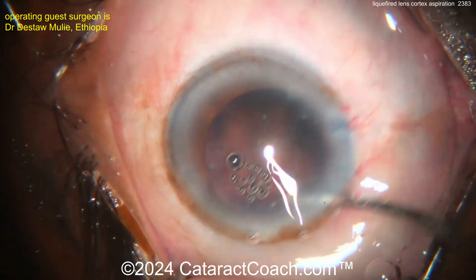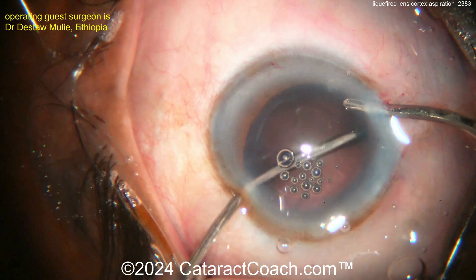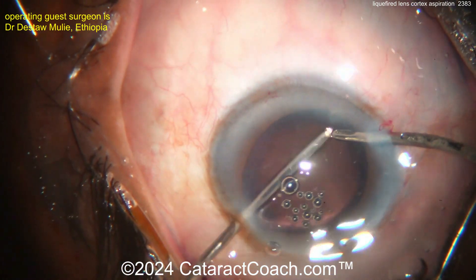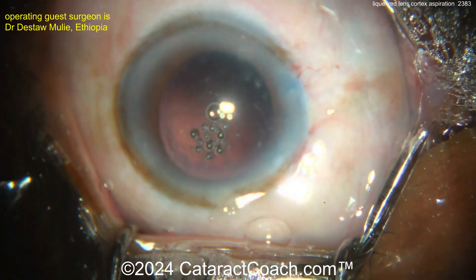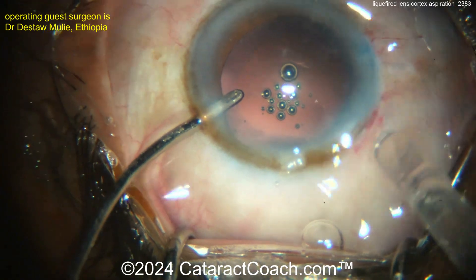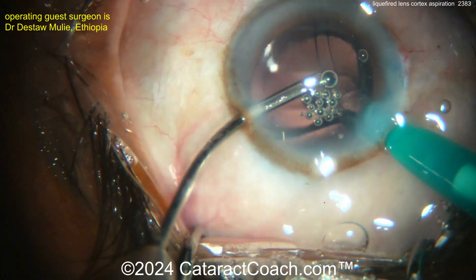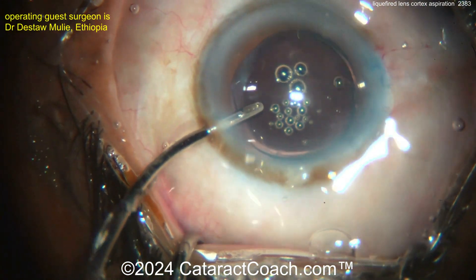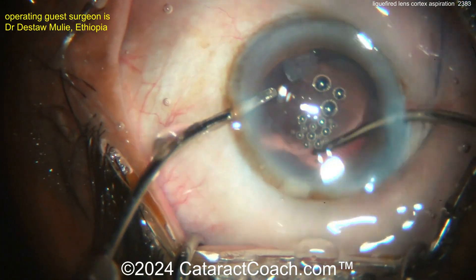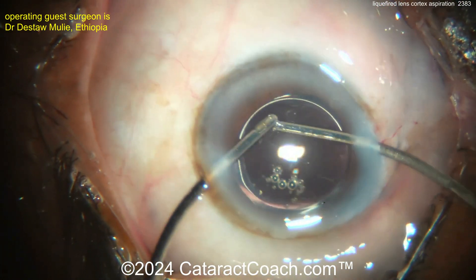Obviously it's hard to do an optical method, so you'll have to do an A-scan. You might ask: should I do immersion A-scan, since that's supposed to be more accurate? That helps because you don't compress or push on the cornea and get a shorter-than-anticipated axial length, giving a more accurate result. But you could actually just do applanation A-scan — even if you end up slightly compressing the cornea and getting a shorter axial length.